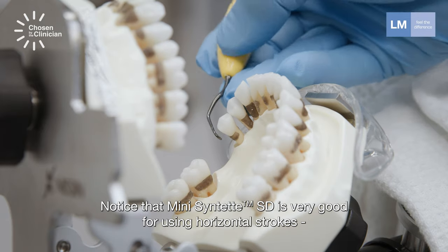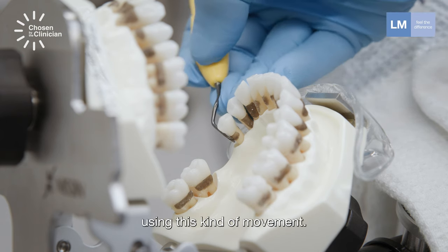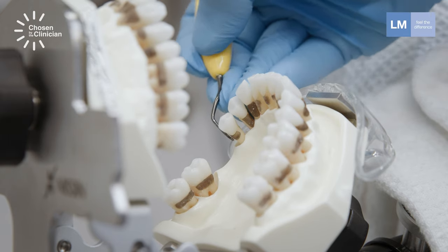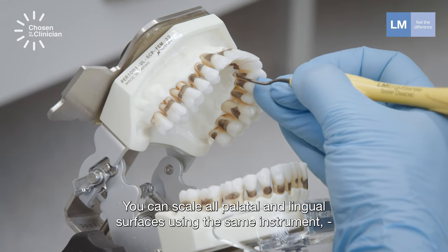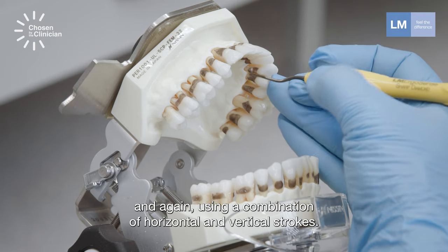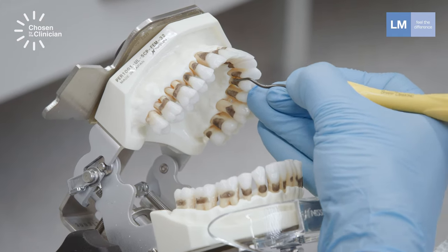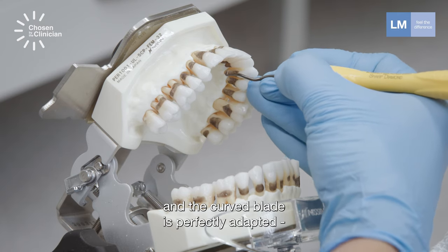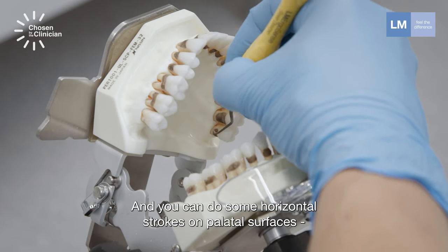Notice that Mini Syntette SD is very good for horizontal strokes with the tip-down or toe-down technique using this kind of movement. This technique is very good for distal surfaces. You can scale all palatal and lingual surfaces using the same instrument, again using a combination of horizontal and vertical strokes, starting at the premolars. The curved blade is perfectly adapted to the cavity of the palatal root, and you can do some horizontal strokes on palatal surfaces.